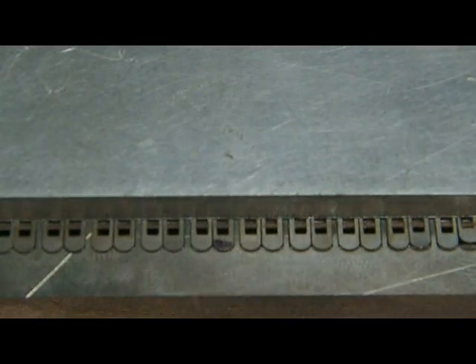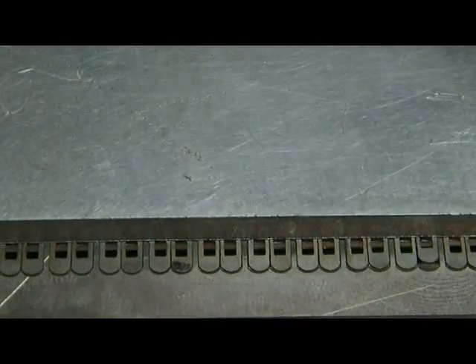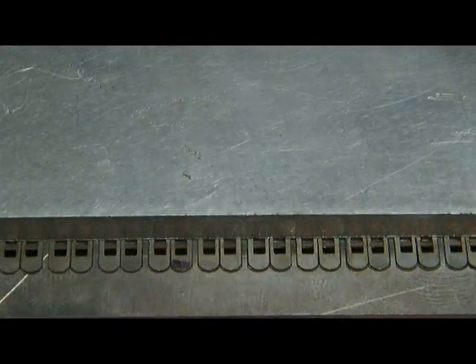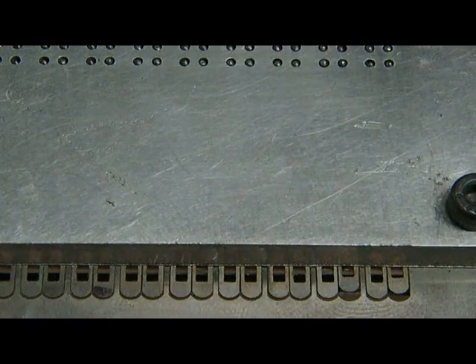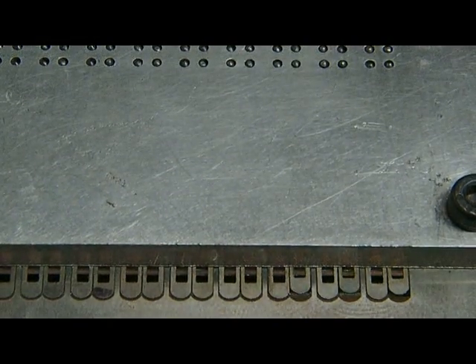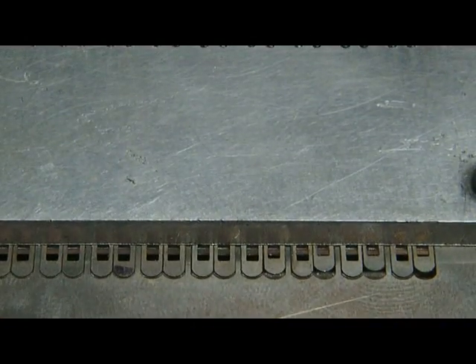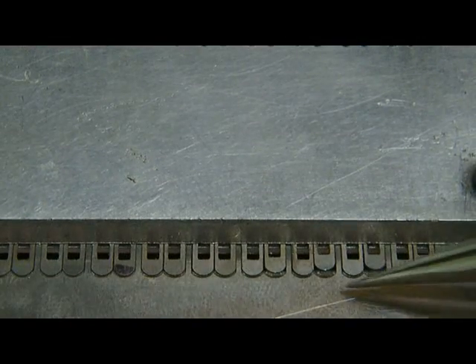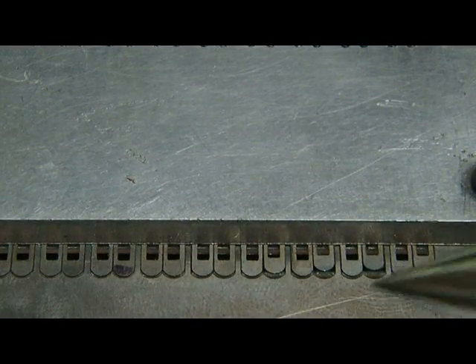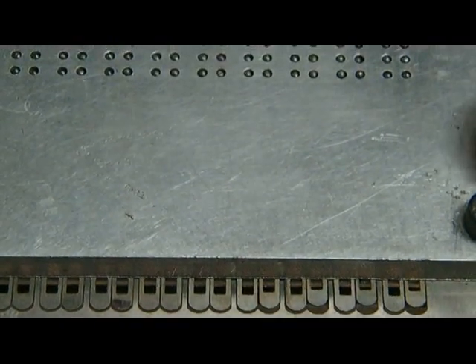I'll show you this first. Okay, we're going to latch the first two columns, or I'll do every first column of every cell. I'm going to latch them. So you can see the latching over here. The gap indicates that it's latched shut. This is latched shut, and then that one is latched shut. That one is latched shut. There's just that 0.5 millimeter gap over there, the little crescent shaped thing.